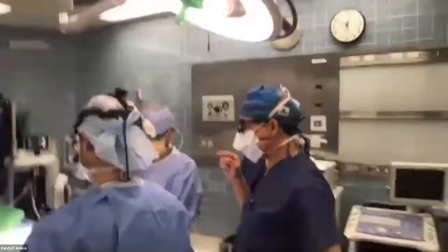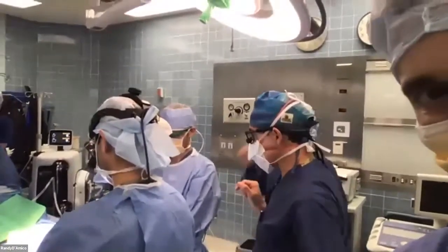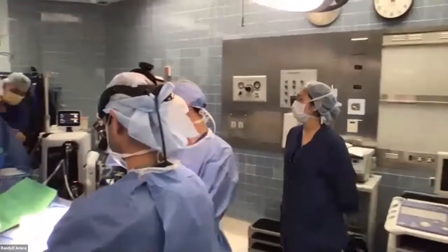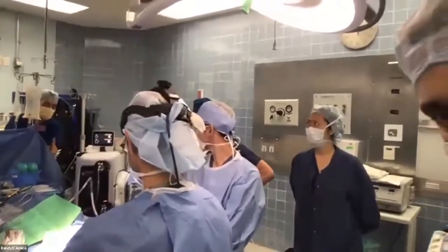Craniotomy. Make sure we have gel foam in case we have sagittal sinus bleeding. Blood should be in the room. Safety precautions of the patient are felt and included. Correct. Antibiotic, anti-epileptic, dexamethasone, mannitol. Patient will go to the ICU post-op.